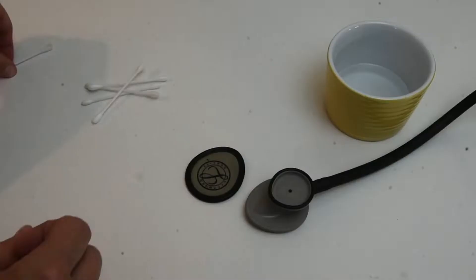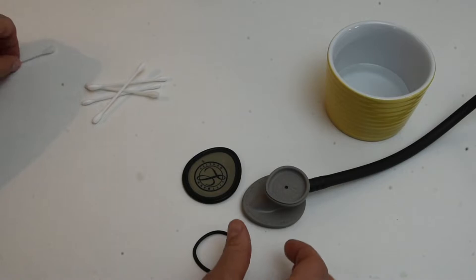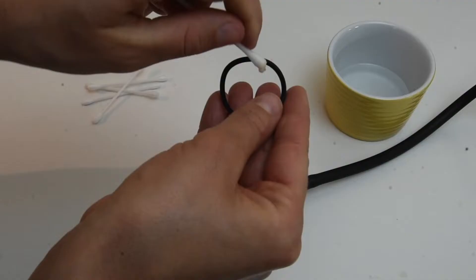Now the bell side — this little plastic thing also comes off. So I would take that off, clean all around in the crevices where bugs like to hang out, and then clean the plastic part thoroughly.